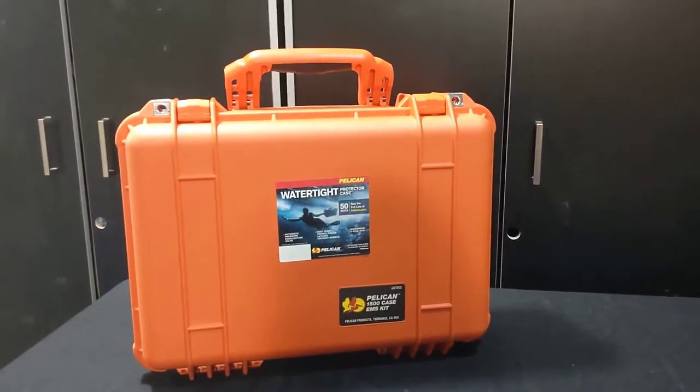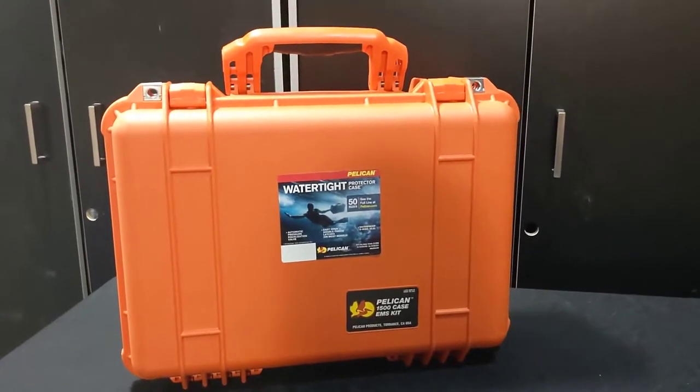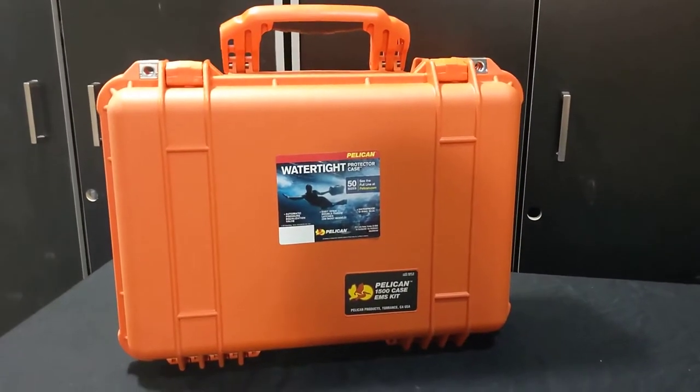This is the Pelican 1500 EMS kit. This is a great case for first aid, paramedic, and event medical use.